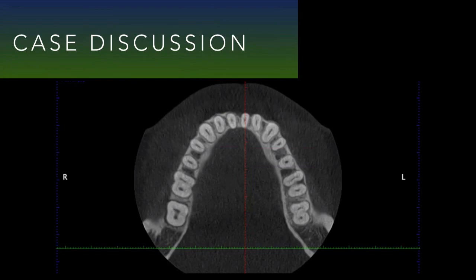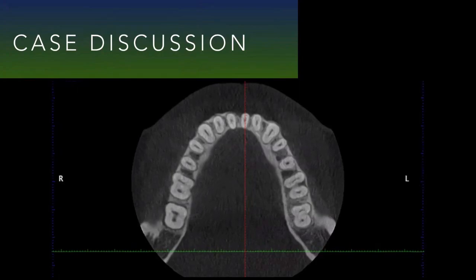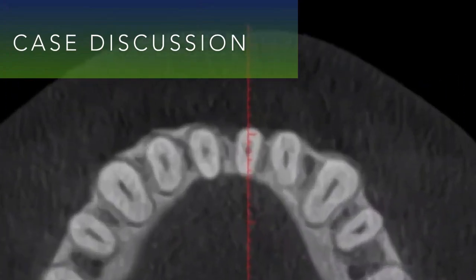And so then I send her back this CBCT, and she does a better periodontal exam and actually finds some subgingival calculus. And I think the reason that there is such significant resorption on that tooth is because it was treated in the midst of periodontal disease. And unfortunately for the patient, I think they've got some concern there. She's since had a gingival graft and some other treatment done. But it's buyer beware when it really comes to these DIY companies that are operating in our healthcare arena.